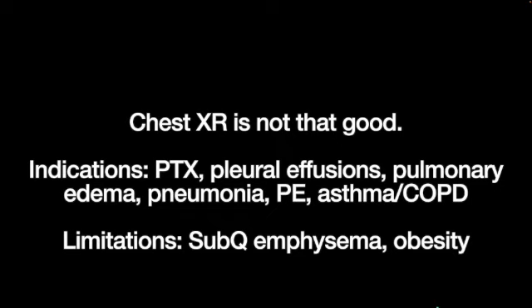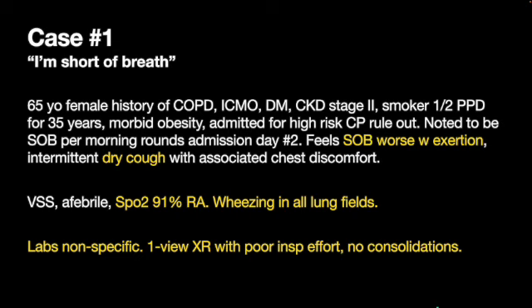Also, obesity. When people have a lot of subcutaneous fat, it attenuates the ultrasound beams and you just can't see well deep to that. So let's talk about a real life case.